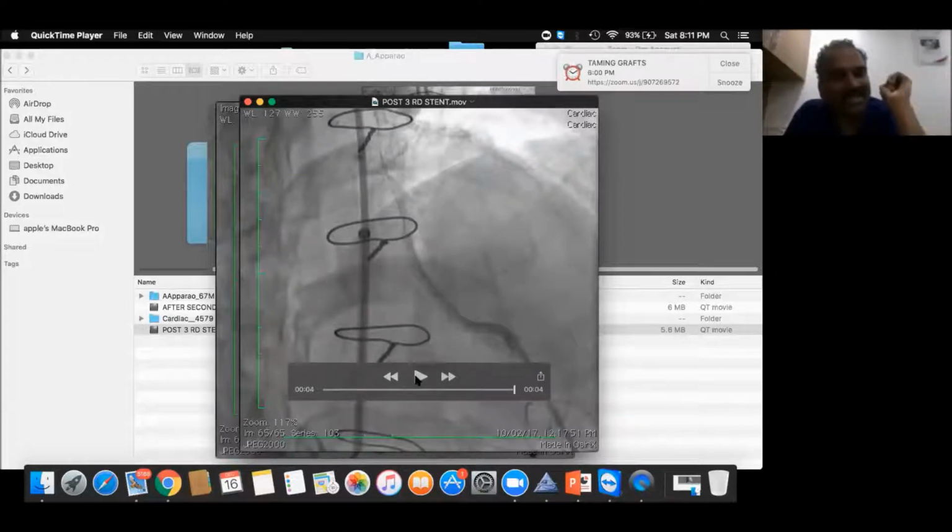That's the reason, for all distal anastomotic lesions, balloon angioplasty is enough. But this is not just an anastomotic lesion. The lesion is extending down as well as proximally. There is an atheroma also there. So that's why we thought of going ahead with stenting.